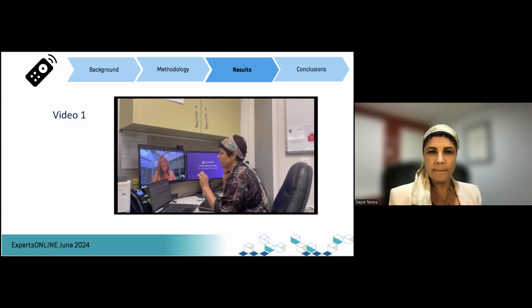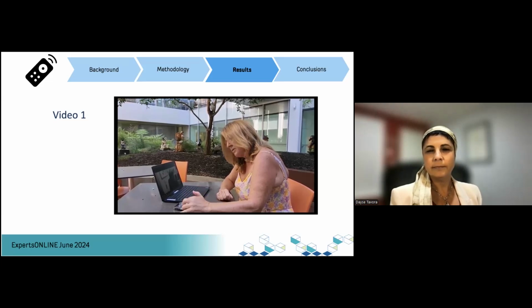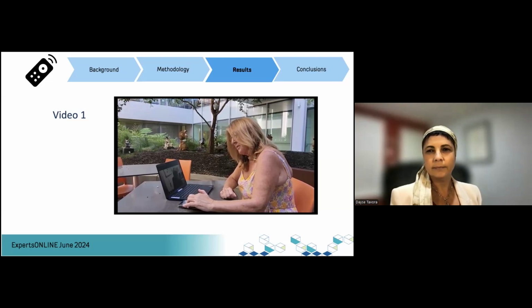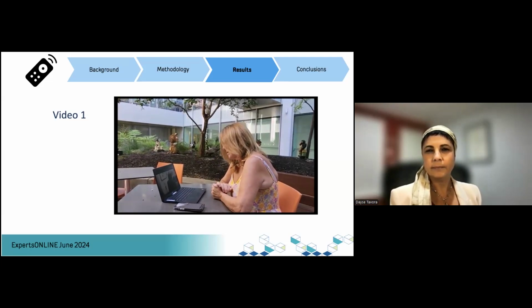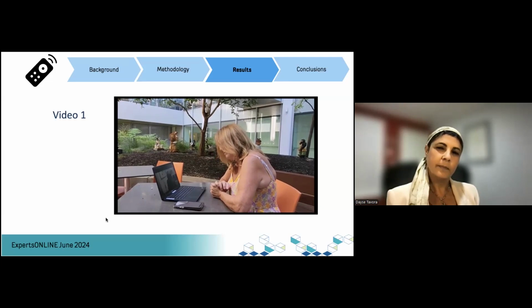So can you please go on the top left-hand side and click on system check? Yep. Just the instructions on this screen. Yeah, it's ticked. Yeah, and that's it. Is it saying that there is no problems found? No issue found and a green tick.